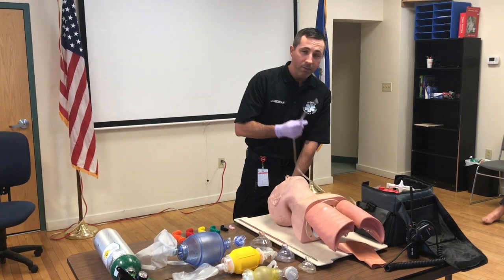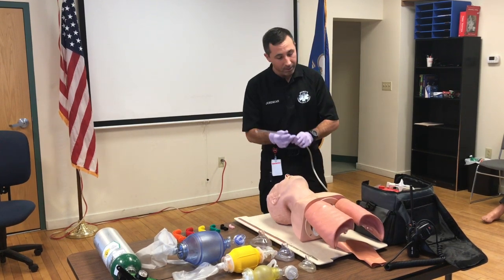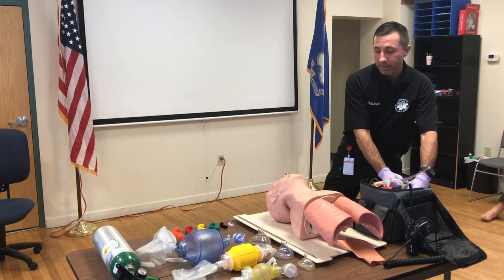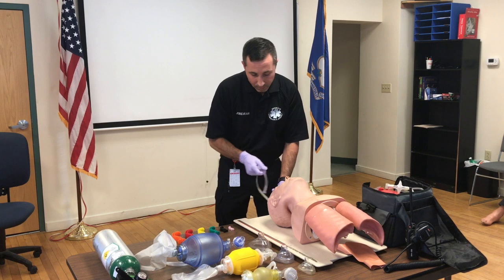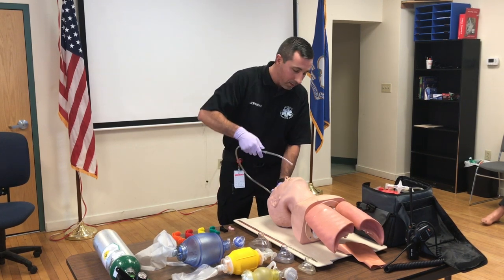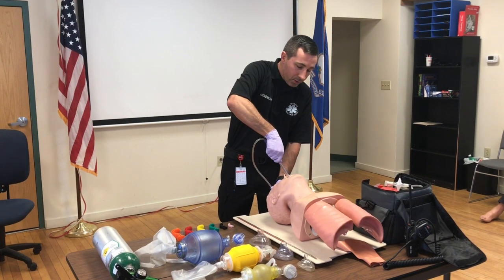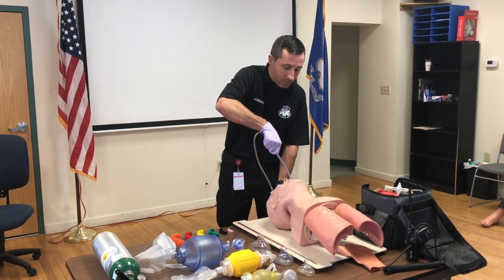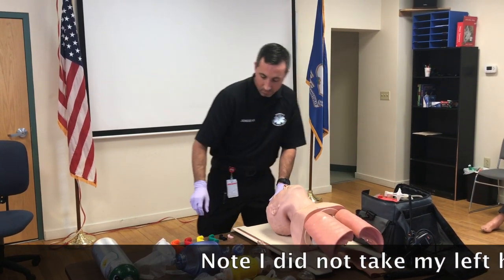So I'm going to prepare my rigid tip suction catheter. We're going to make sure that all the tubing is connected. I'm then going to turn my suction device on. I'm going to reposition my airway, measure from the corner of the mouth to the tip of the ear. We're going to insert no further than I can see. I'm then going to initiate suction on the way out in a circular motion for no more than 15 seconds. The mouth and oropharynx are clear.